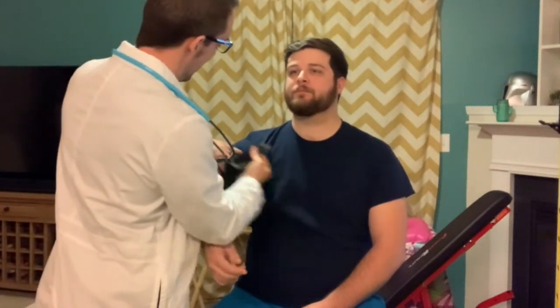I'm going to check your pulse. About 20 beats in a 15-second period, so about 80 beats per minute. I'm just going to take your blood pressure now. I'll be doing a palpable systolic blood pressure. I'll be listening.